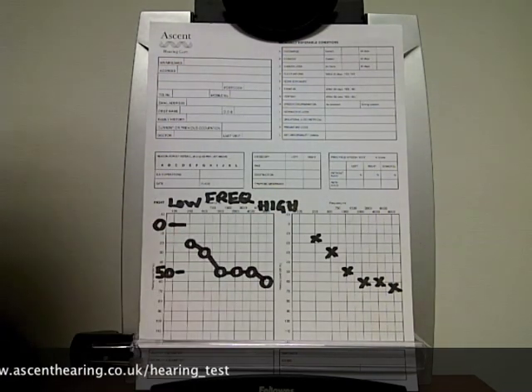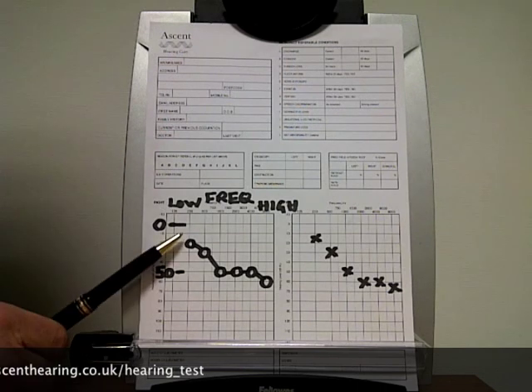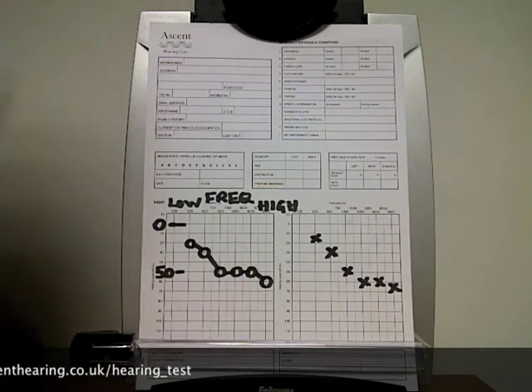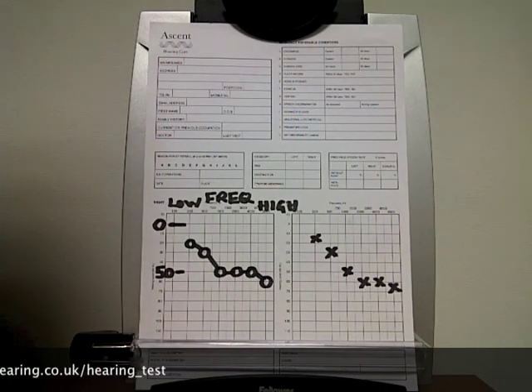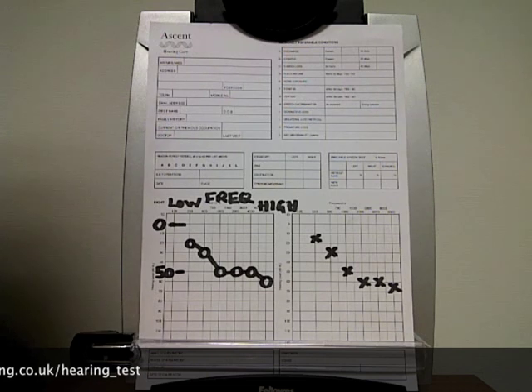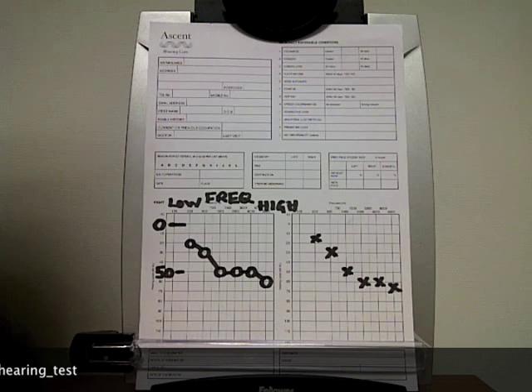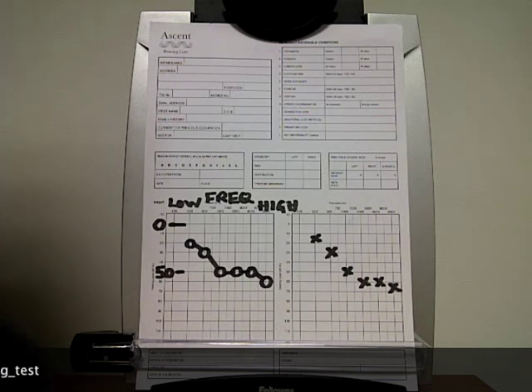This particular client's air conduction thresholds show us a moderate to severe high frequency loss in both ears. We've got other tests to do, which I'll explain in a subsequent video — in particular, bone conduction testing — and that will help us to figure out where the problem lies.